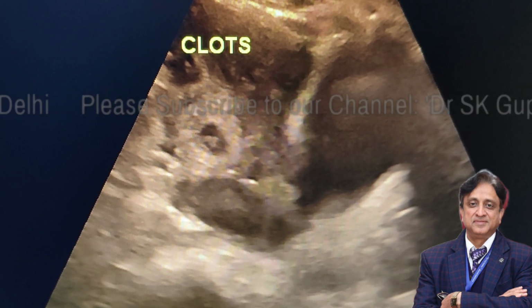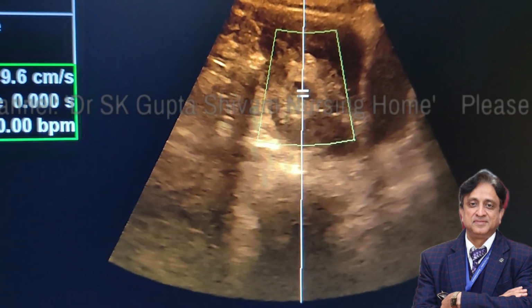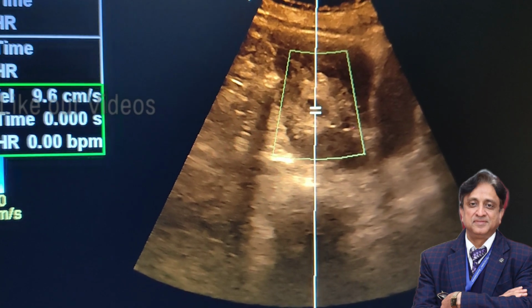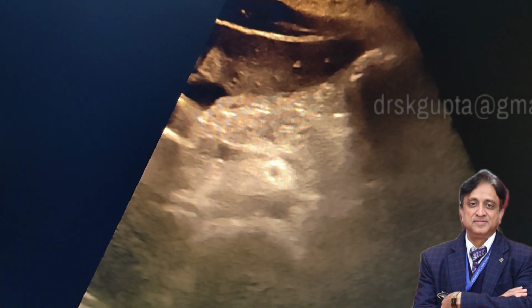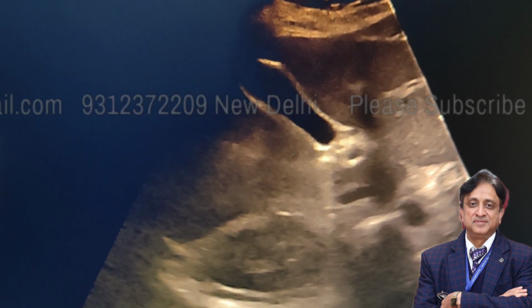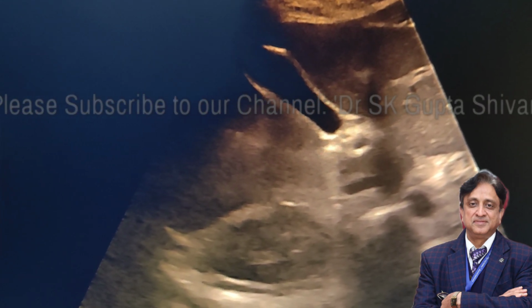If I try to look for the heart activity in this sac-like structure, I find that there is no cardiac activity. So probably we are dealing with a case of ruptured ectopic in a young patient who has come to us with severe pain and free fluid in the hepatorenal recess and the complex fluid in and around the uterus with this empty uterine cavity. All these features suggest that we are dealing with a case of ruptured ectopic.